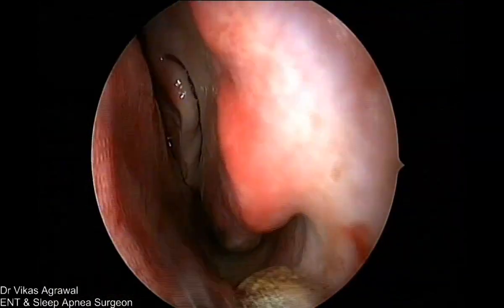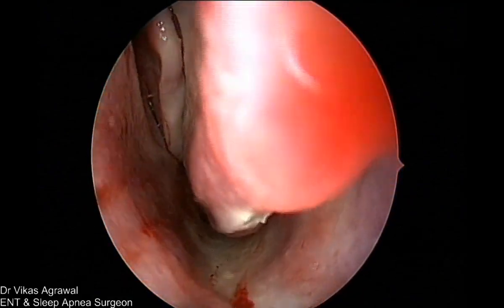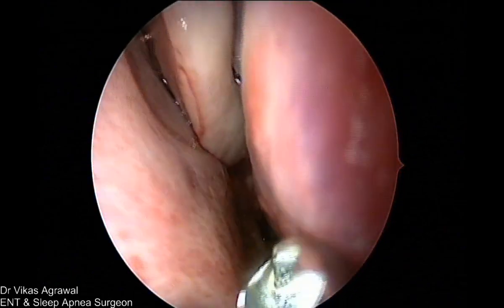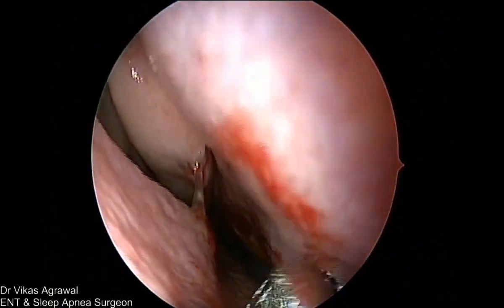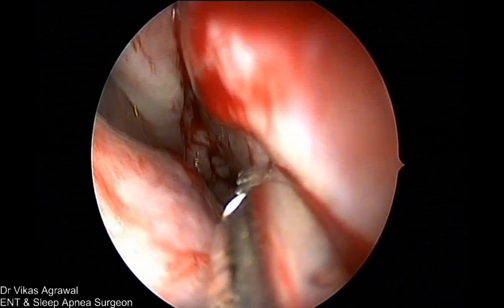See, I'm just checking on my suction cautery. Yeah, it's working fine. So what I'll do is I'll start from the posterior most part. Let me start on the right side. It's definitely gonna bleed. So please forgive me for the bleeding.